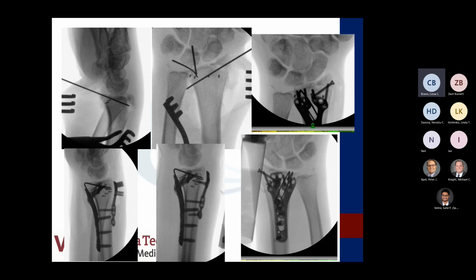So that's why understanding the pattern and going after them, and then addressing the ligamentous support and then your bony structures. And because it was so distal and so small, that's why we did that spring technique, because we didn't think we could actually get it as well with the hook plate or separate screw, because it was fairly comminuted. Yeah, I like that technique. That was my first time doing it, and it turned out nicely.